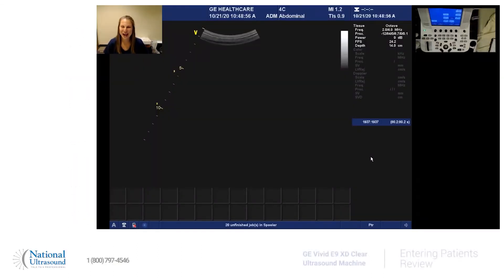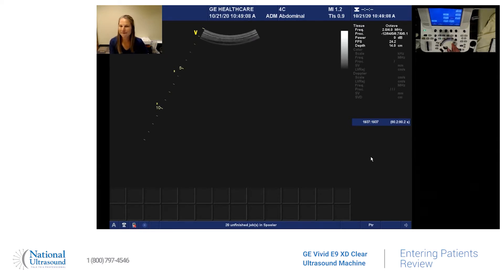Hi, my name is Jackie Klebeck. I've been a registered cardiac, vascular, and general sonographer for eight years. I'm here at National Ultrasound on a Vivid E9 using a 4C probe. And today I'm just going to show you how to enter patient information.